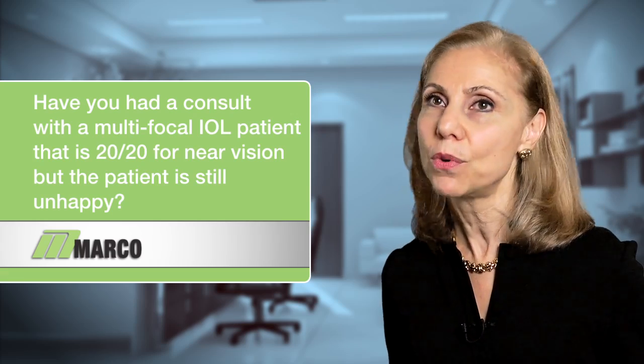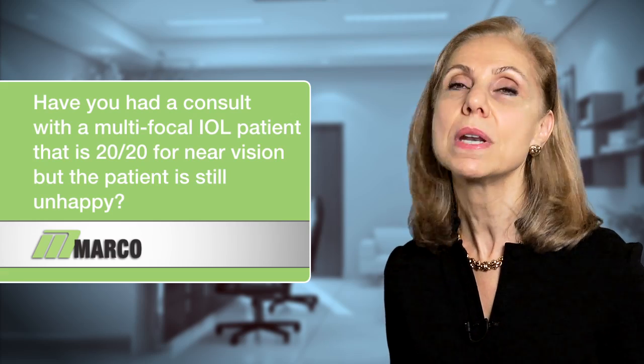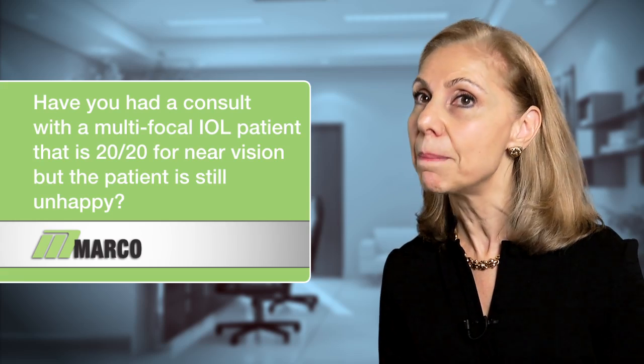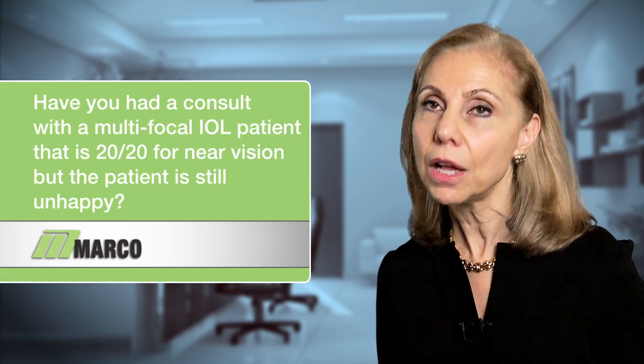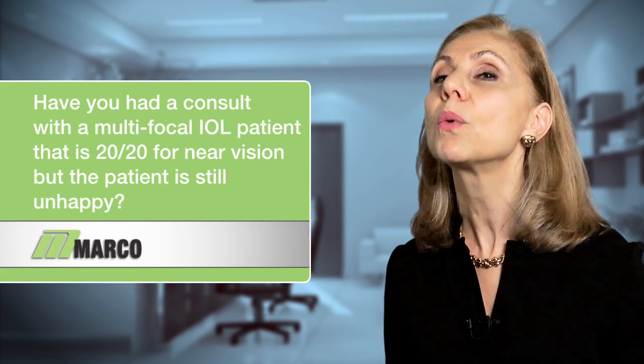Had it not been for the OPD-III, I too, like her ophthalmologist, would not have known what the problem was. Because I was able to measure and calculate the positive angle kappa in this patient, I was able to come up with a solution for her.